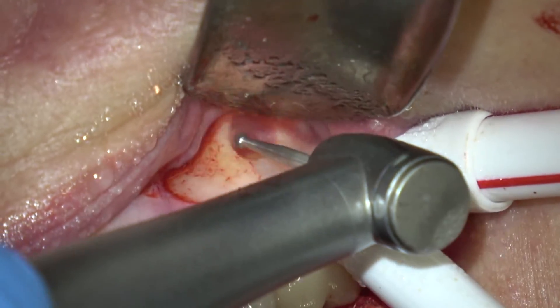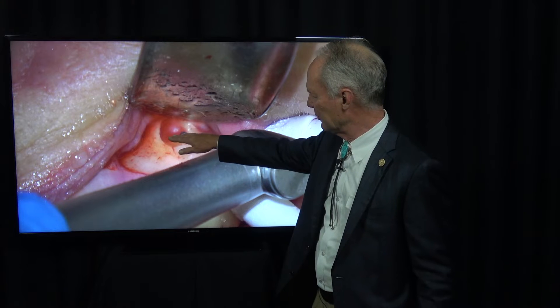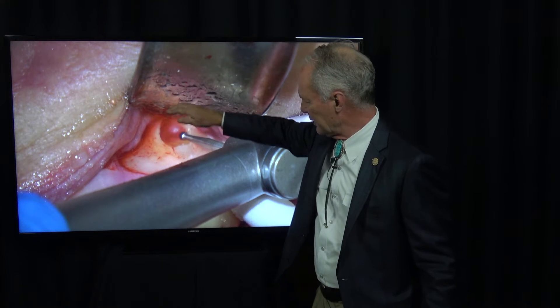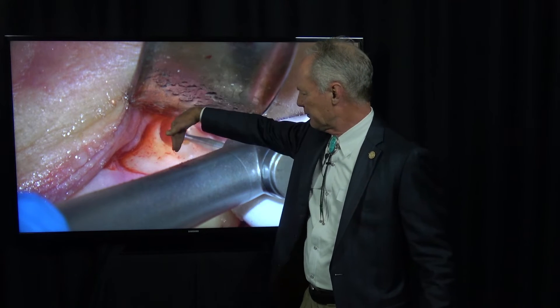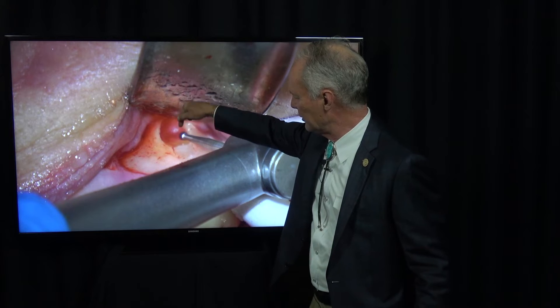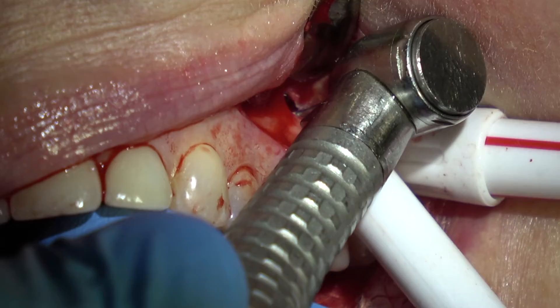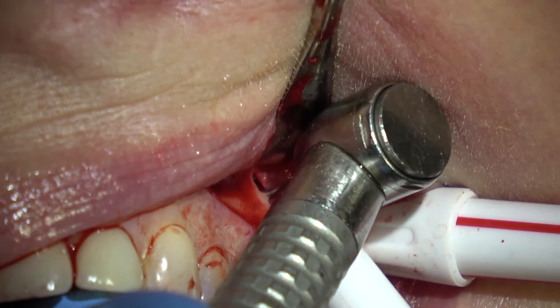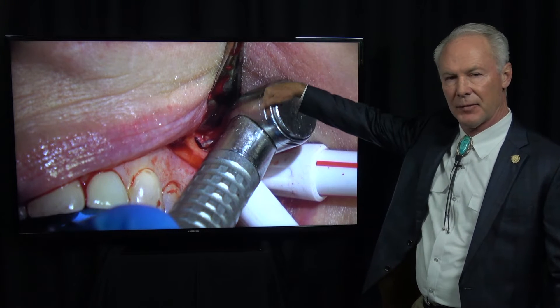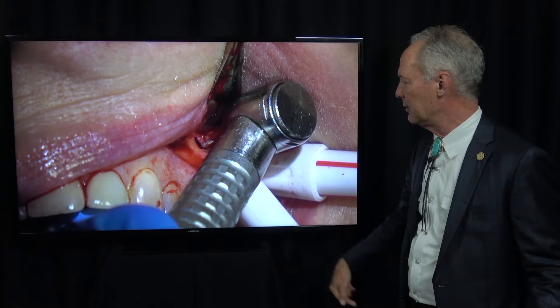When you make this cut — when you sever the root tip — you want to be sure the cut is angled like this, not perpendicular to the root, because you can't retrofill easily a root that's cut perpendicular. You want the cut to be angled so you can retrofill it. You can see my angled cut right here. This is a tiny number one round burr to make a slight divot in the tip of the apical part of that root — that's where you're going to place the retrofill.